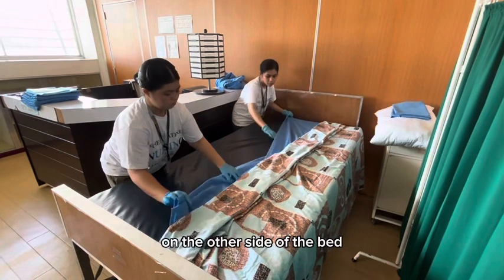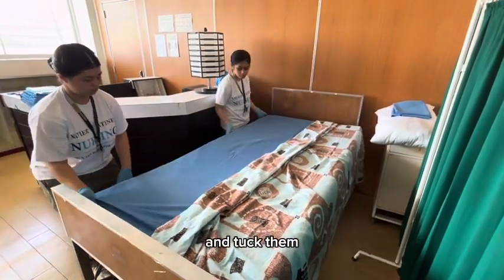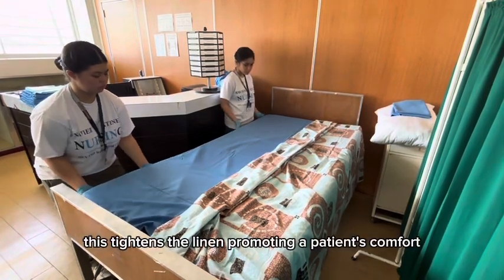On the other side of the bed, pull the sheets from the bottom sheet to the top sheet and tuck them. This tightens the linen, promoting the patient's comfort.